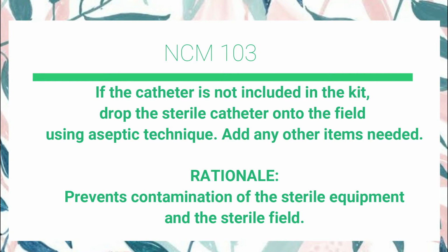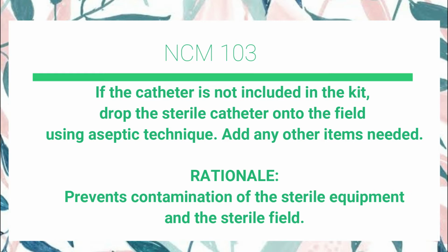If the catheter is not included in the kit, drop the sterile catheter on the field using aseptic technique. Add any other items needed. It prevents contamination of the sterile equipment in the sterile field.